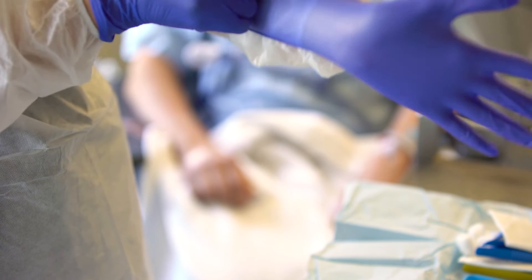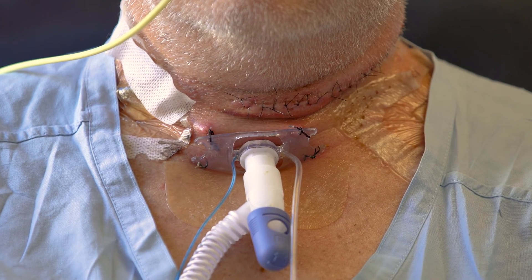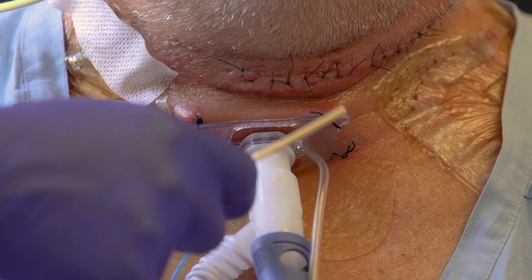Perform hand hygiene and put on PPE. Patients who have had microvascular free flap surgery will have the tracheostomy tube held in place by sutures through the tracheostomy flange, rather than by tapes or ties.